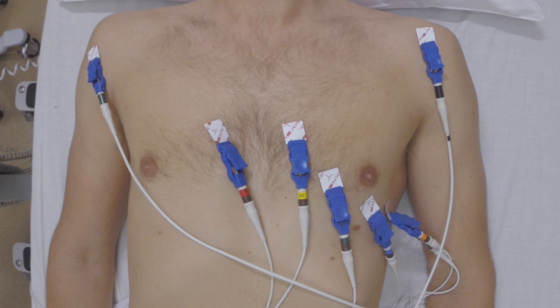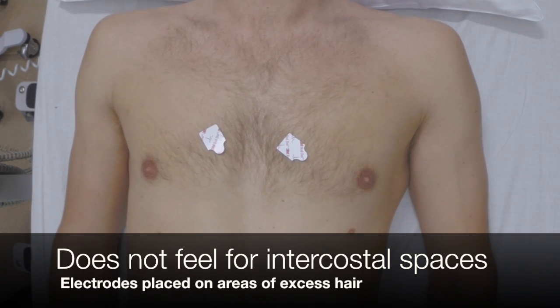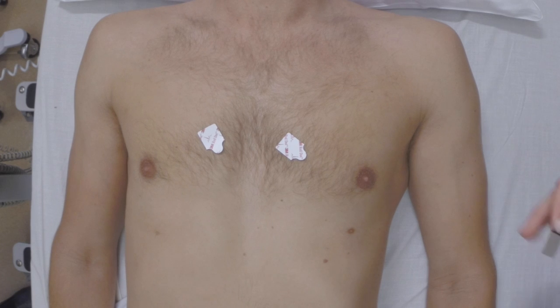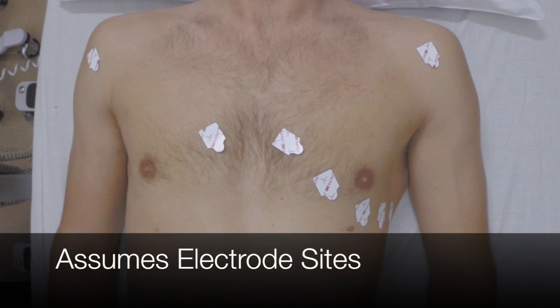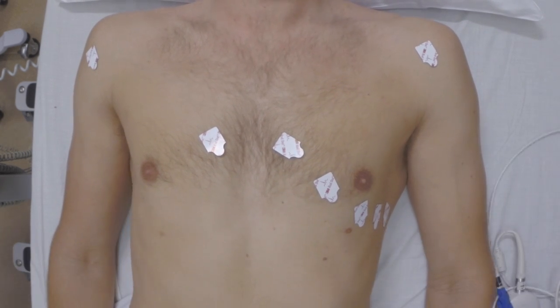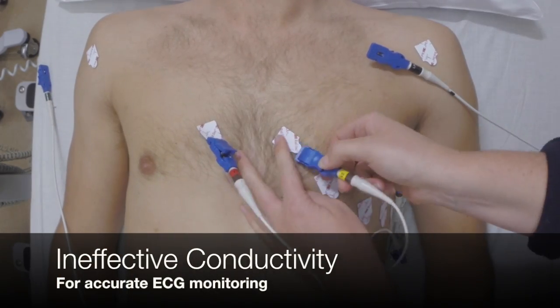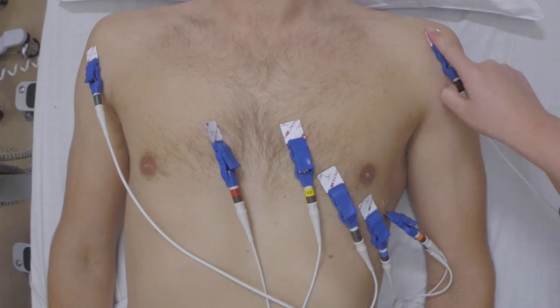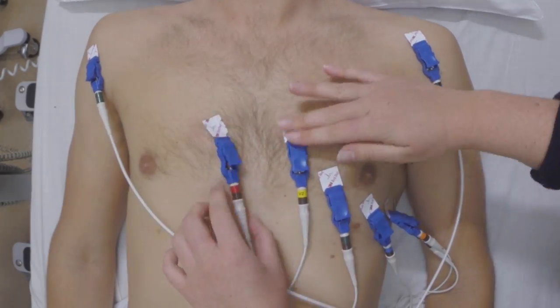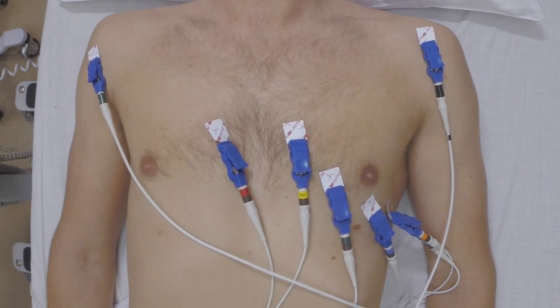The following scenario shows the common practice of assuming the anatomical location of the electrodes. Research found that the degree of error in precordial electrode placement can range from 2 to 3 cm, but occasionally reached even 6 cm from its correct site for optimal ECG monitoring. You can also see that the nurse neglects to detect that the electrodes do not have effective conductivity due to poor contact with skin and has not displayed problem-solving abilities to rectify this. For example, the V1 and V2 electrodes have been placed on an area with excess hair, and the left torso position limb lead has not stuck at all as a result of a diaphoretic patient.